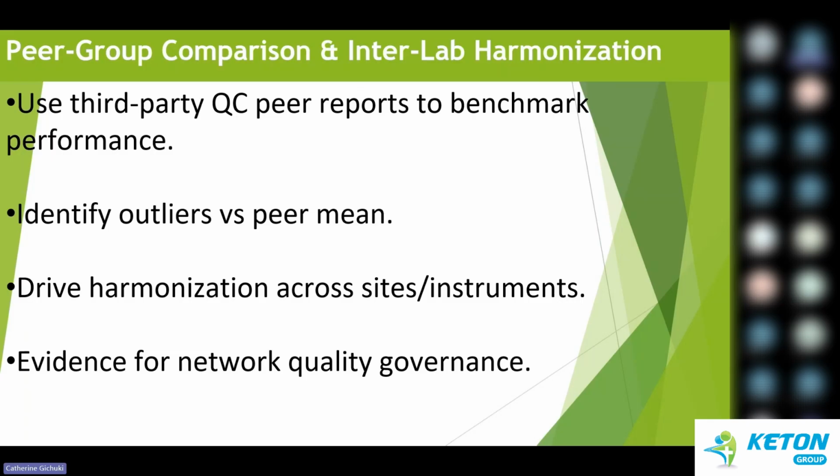Peer group comparisons and interlab harmonization. We want to compare our lab QC performance with other labs. We want that when somebody comes to Nairobi West Hospital and does, for example, thyroids, and then goes to Mata or Karen, there's not that variation where somebody is receiving treatment here and at the other place they're being told that they're okay. So we use that information to make results more consistent across branches and machines.